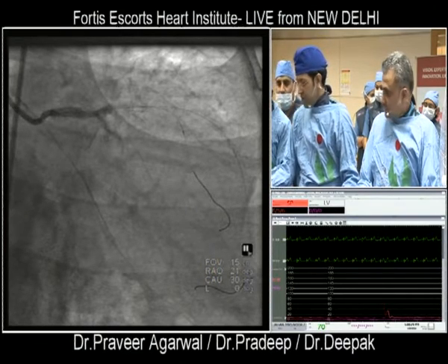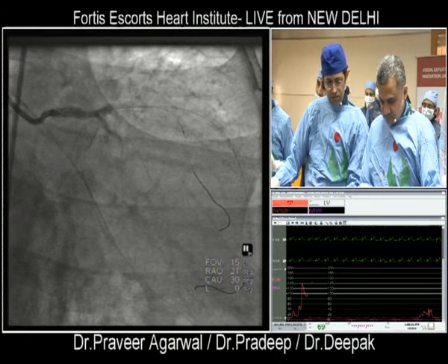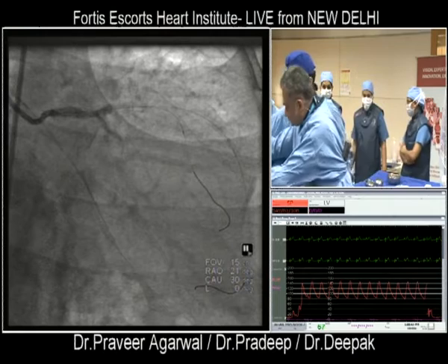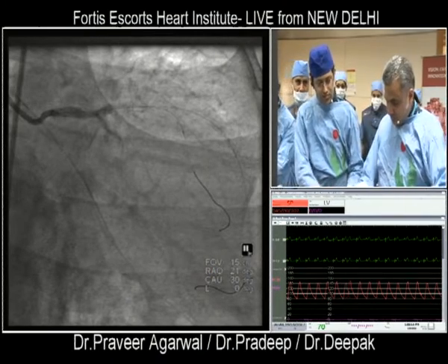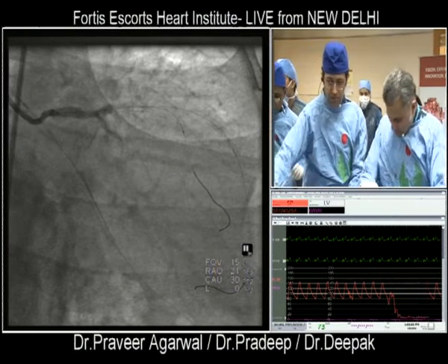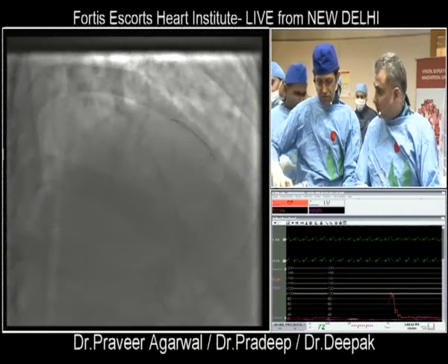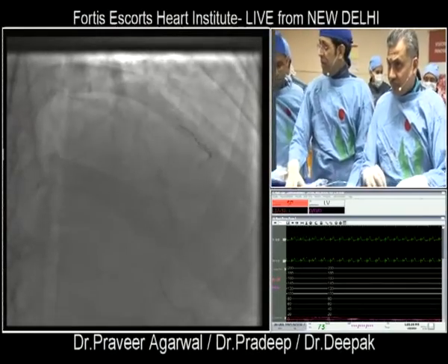Okay, ready? Yes, ready. Flush. This should be ready with this pattern. Okay, yep, this is fine. Is it an automatic pullback? Do you have the... Yeah. Give me the pullback. Automatic pullback.